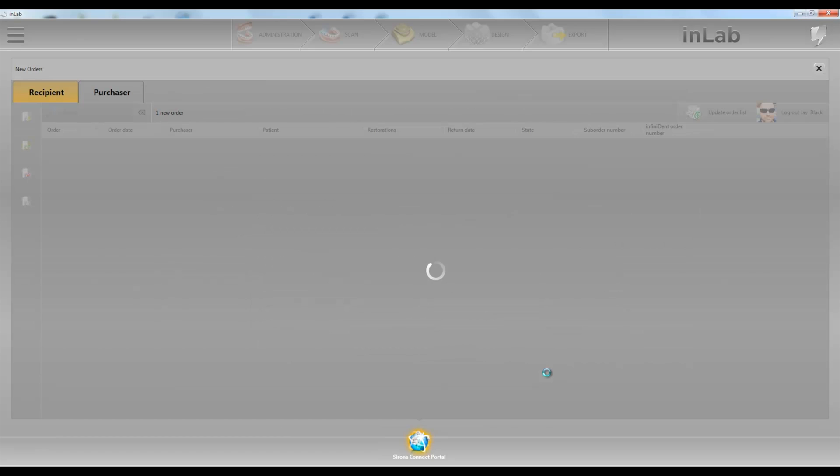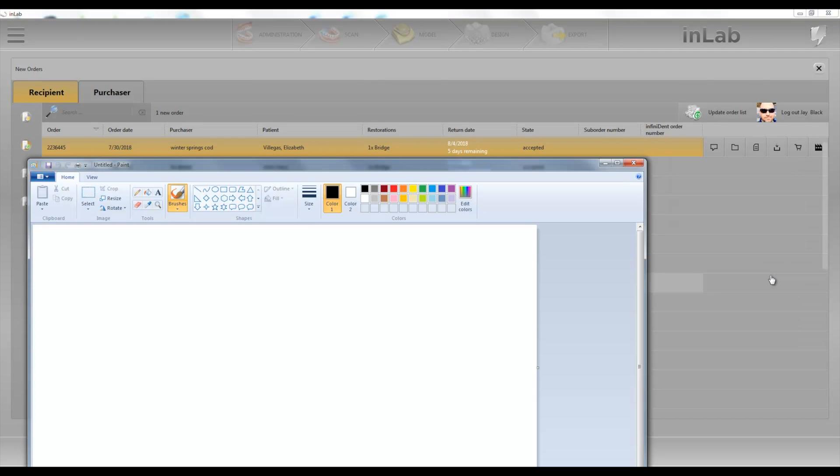Click accept. Okay, so now we have our case here and we want to go and send it to a different lab.